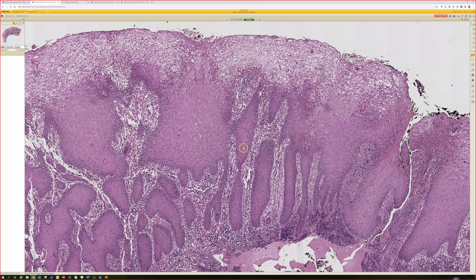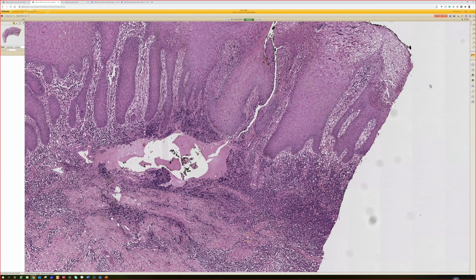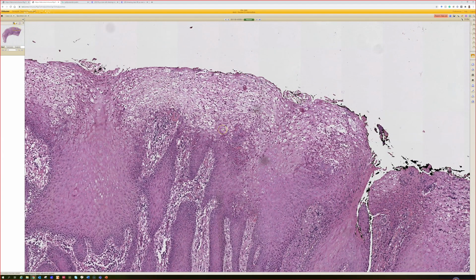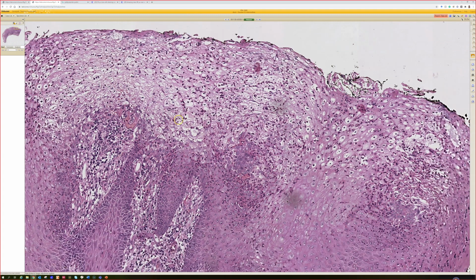Some of the things that help me: in addition to epidermal hyperplasia, kind of psoriasiform with elongated rete, even though it's really thick, thicker than regular secondary syphilis, you still get that long rete like you normally get in syphilis. Tons of plasma cells, although remember, in genital sites plasma cells are pretty common in the dermis in a lot of settings, but it's always worth thinking of syphilis. And up here, in the few cases I've seen, this was pretty characteristic: a lot of neutrophils up in the epidermis, and there's edema and pallor and a ballooning degeneration, almost like the ballooning degeneration you see in hand, foot, and mouth disease. So those are clues to think of.